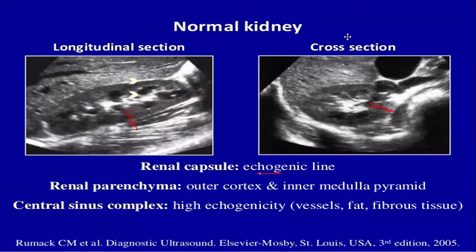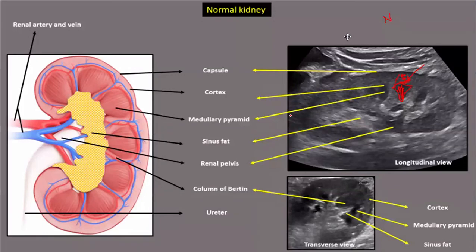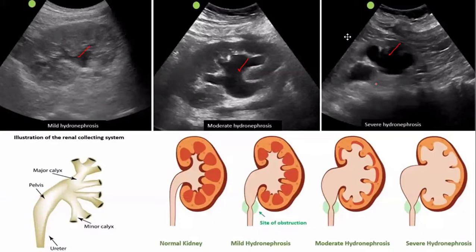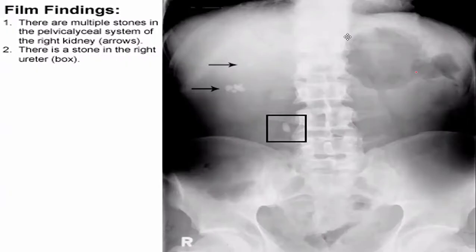Okay, so that's a normal one. Very good. So now, according to what you said also, the film findings. You said calcium stone or struvite stone, the magnesium ammonium phosphate or the staghorn calculi, right? Staghorn calculi, struvite stone, they're just the same terms. Or magnesium ammonium phosphate stone, the infection stones.